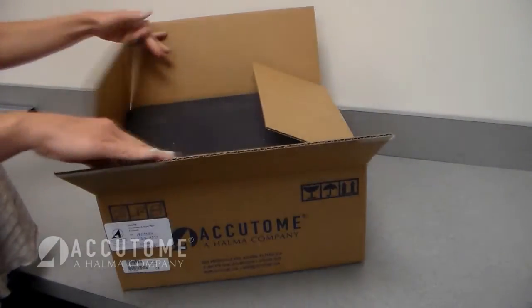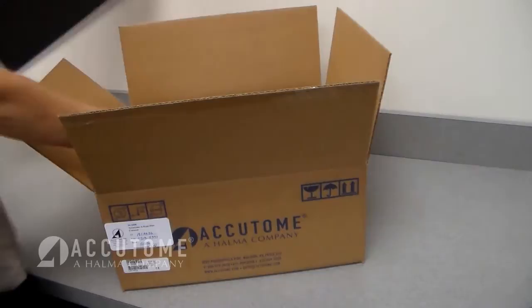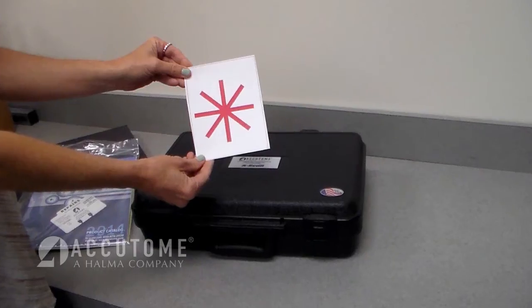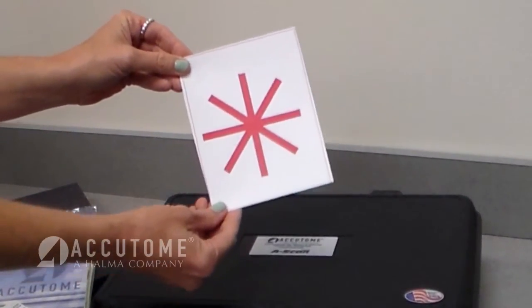Opening the box. When the ASCAN Connect first arrives, open the shipping container. Remove the literature packet containing the fixation target and ASCAN carrying case. The fixation target can be placed on the ceiling above the head of the exam chair to help the patient fixate.